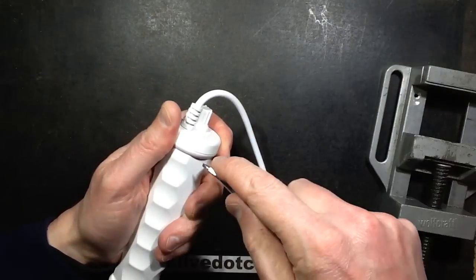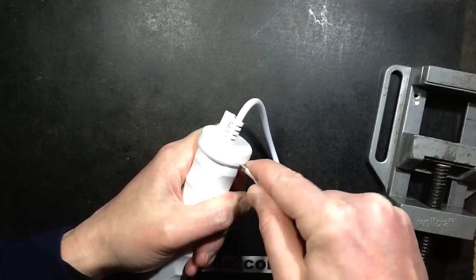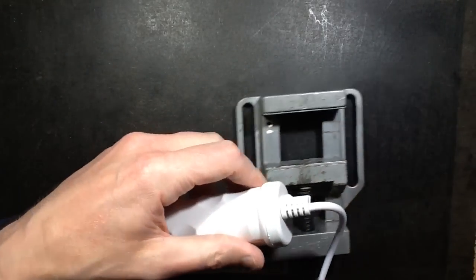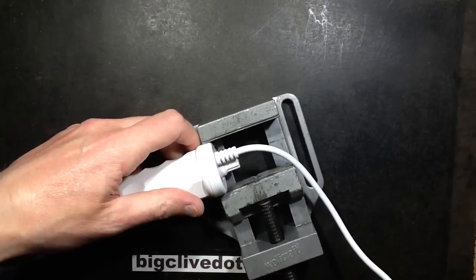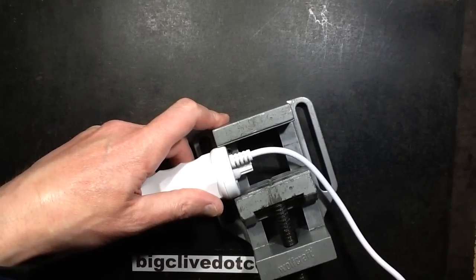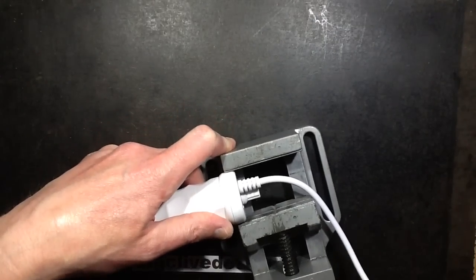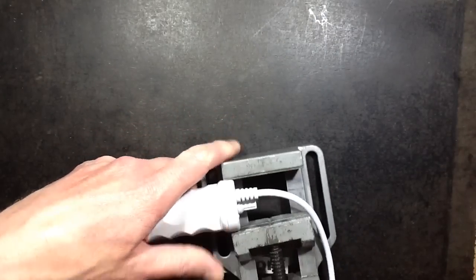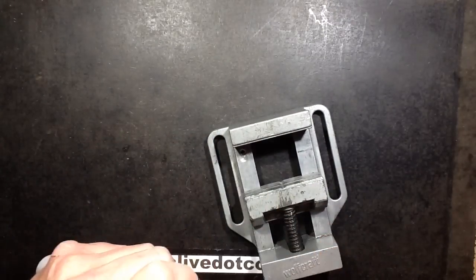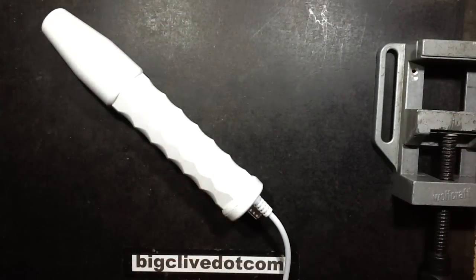I'm not too fussed about preserving the integrity of this because I've got to take it to bits, and to be honest, like most Chinese stuff, it's ridiculously cheap. This unit came from eBay and it cost about £14, including shipping, from I think it was Delhanway, I'm not 100% sure. Yeah, this isn't going to come apart easily, is it? Let's see if I can find something that will use brute force.